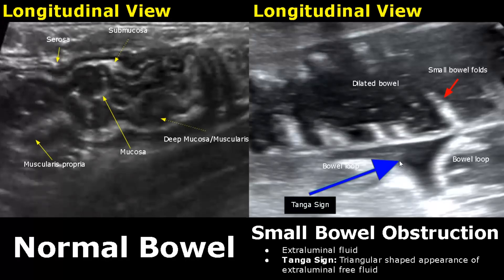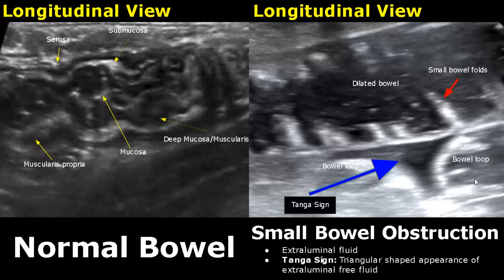Extraluminal fluid may also be seen in some cases of obstruction. Fluid will be visualized outside the bowel and is found between neighboring bowel loops — it is triangular in shape, and this fluid collection is called the tanga sign.